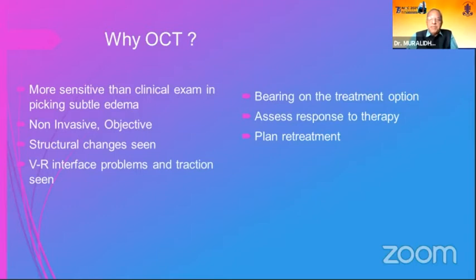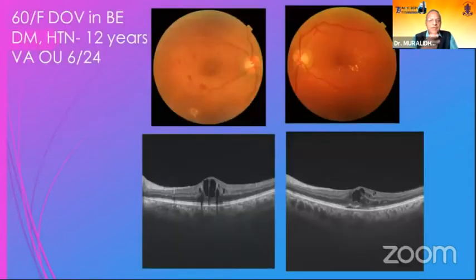So all this has bearing on the treatment of the condition. We need to assess the response to therapy and plan retreatment. All this is possible only with the help of OCT.